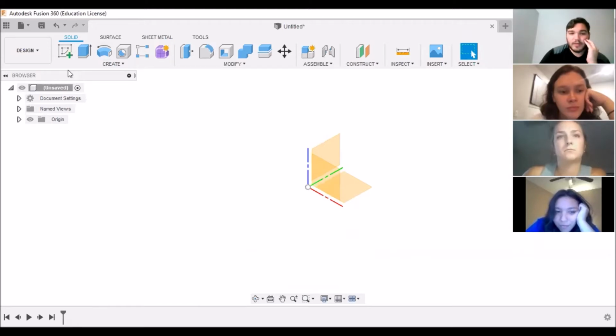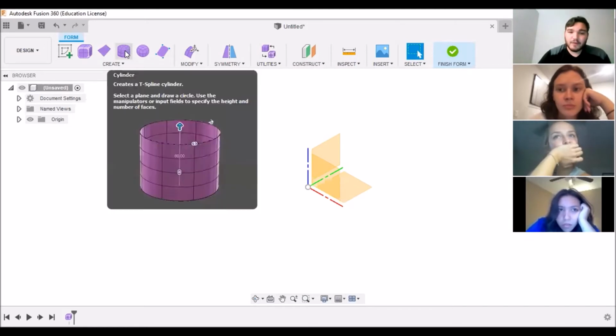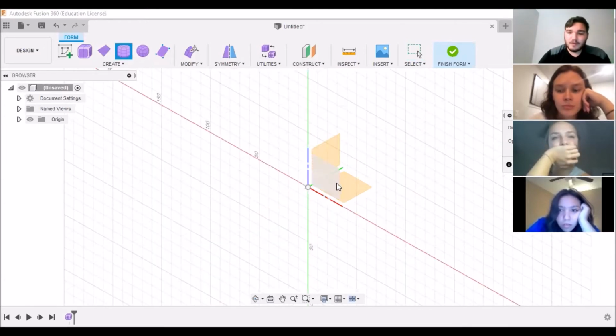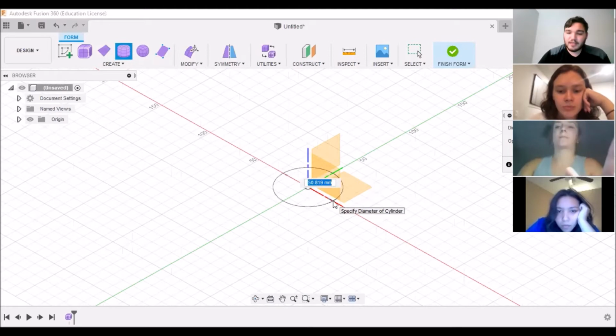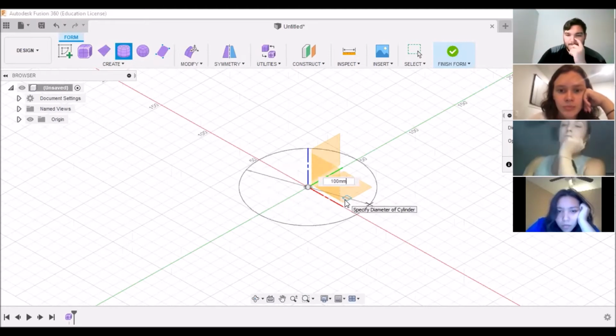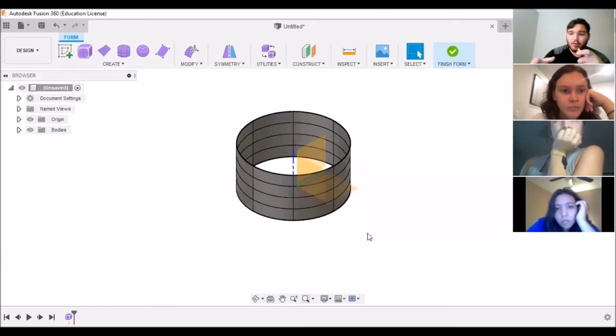From here, we can go up to this purple cube called create form at the top of the bar. Once we create form, we're given a new set of parameters, and we can basically do everything that we did at the beginning. So we have a cylinder that we can choose from. We click on the cylinder, click on the bottom plane, start at the origin, and give it a specific diameter. Now, instead of just being a circle, we're actually given some form or shape.